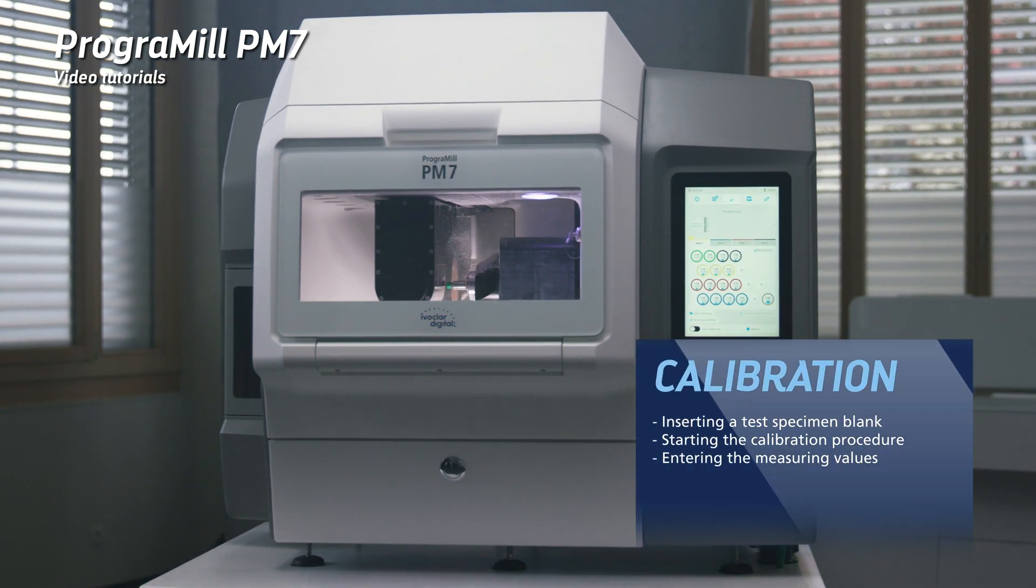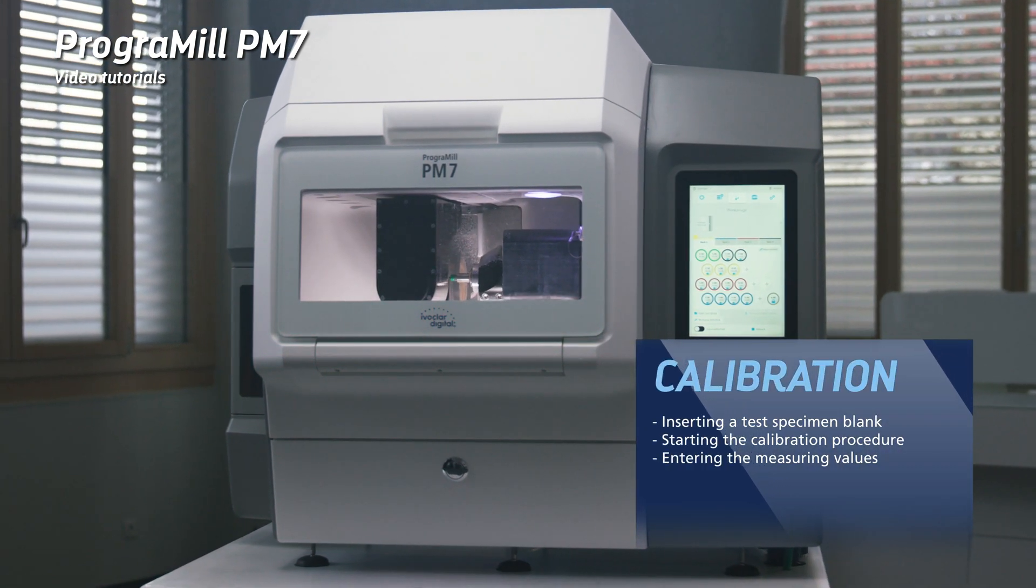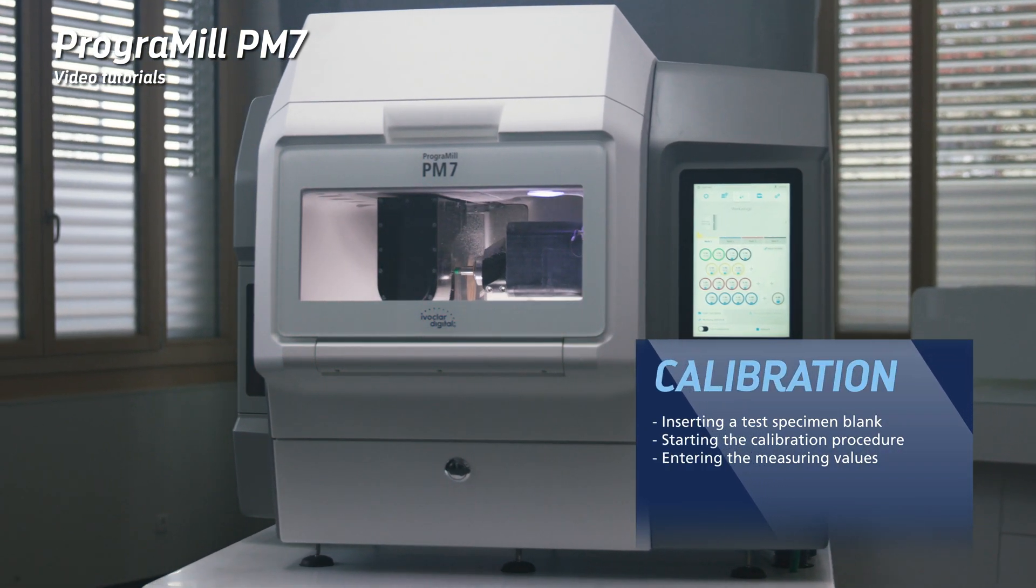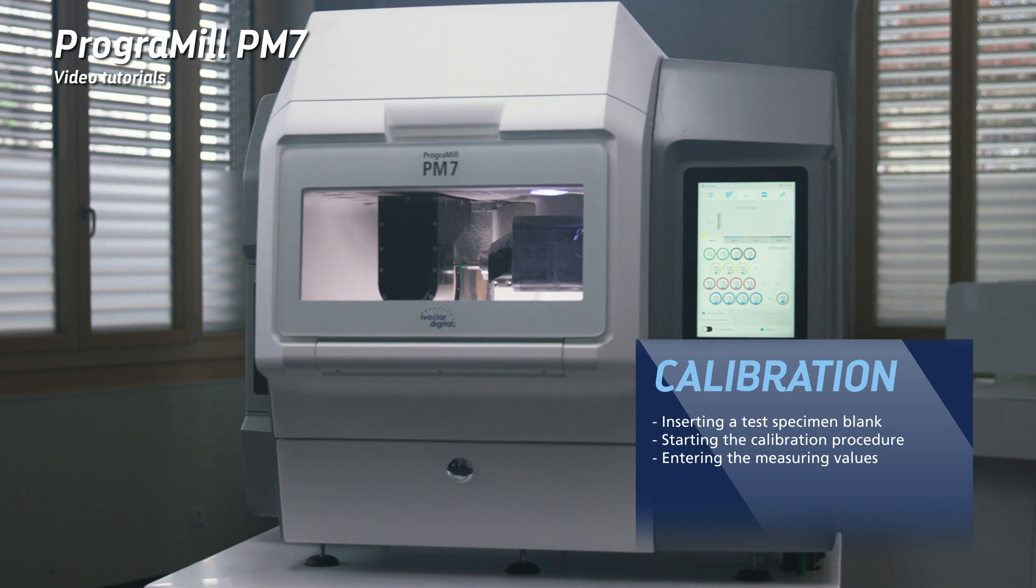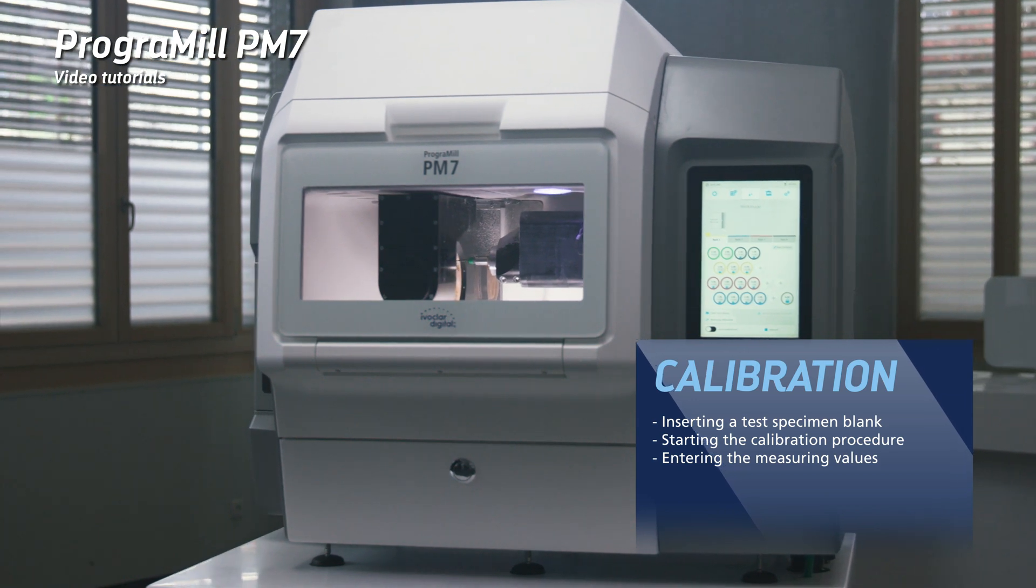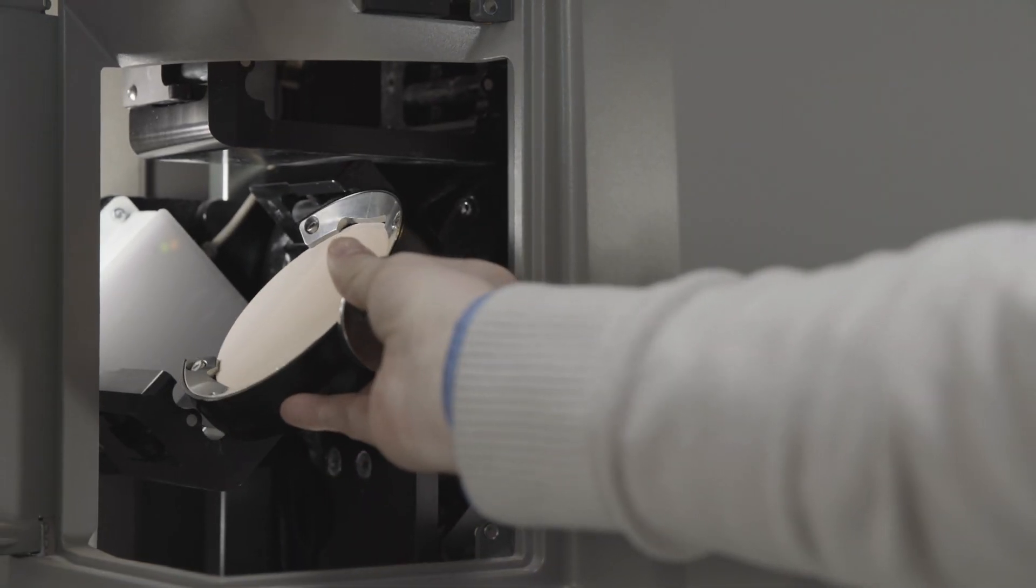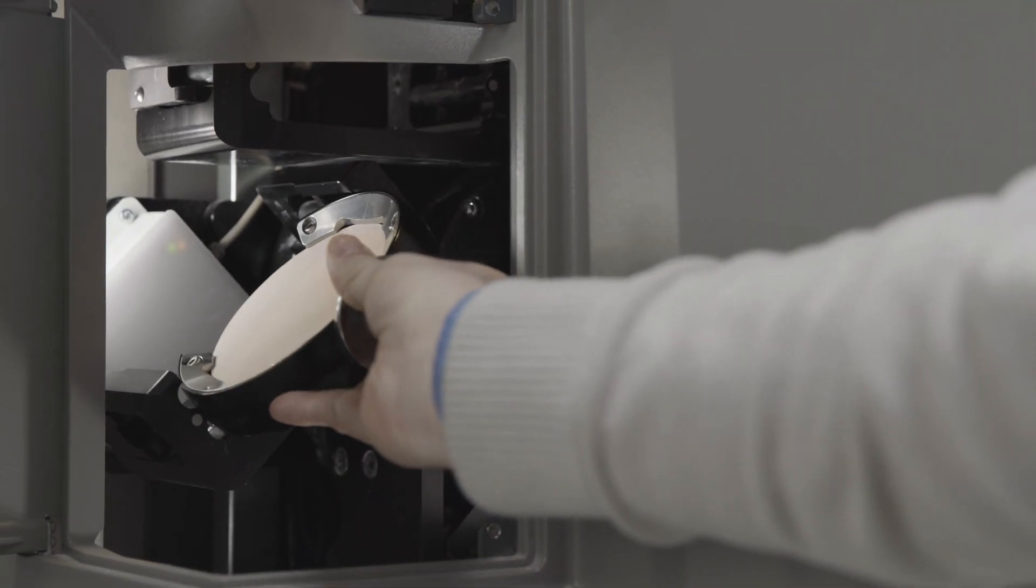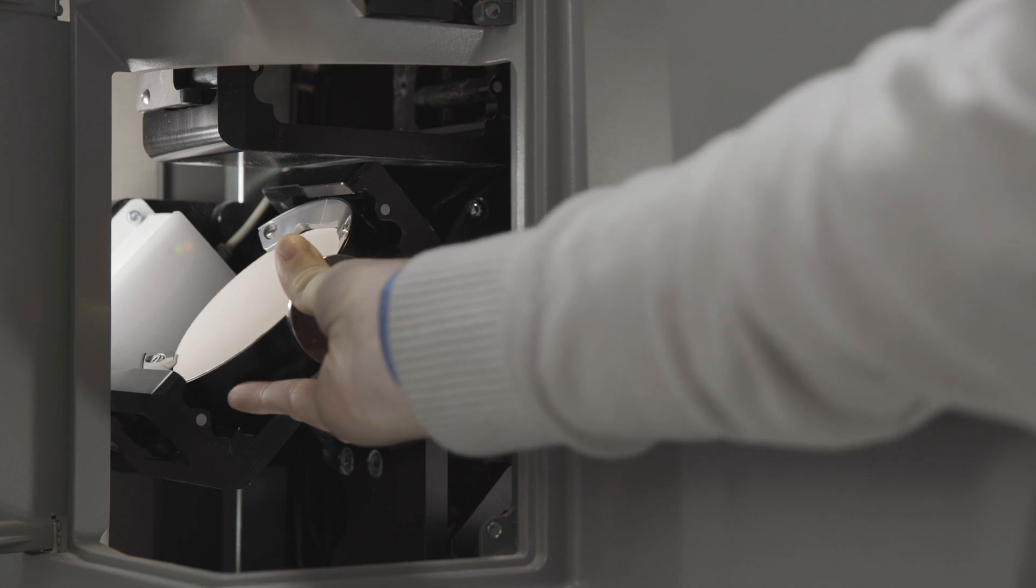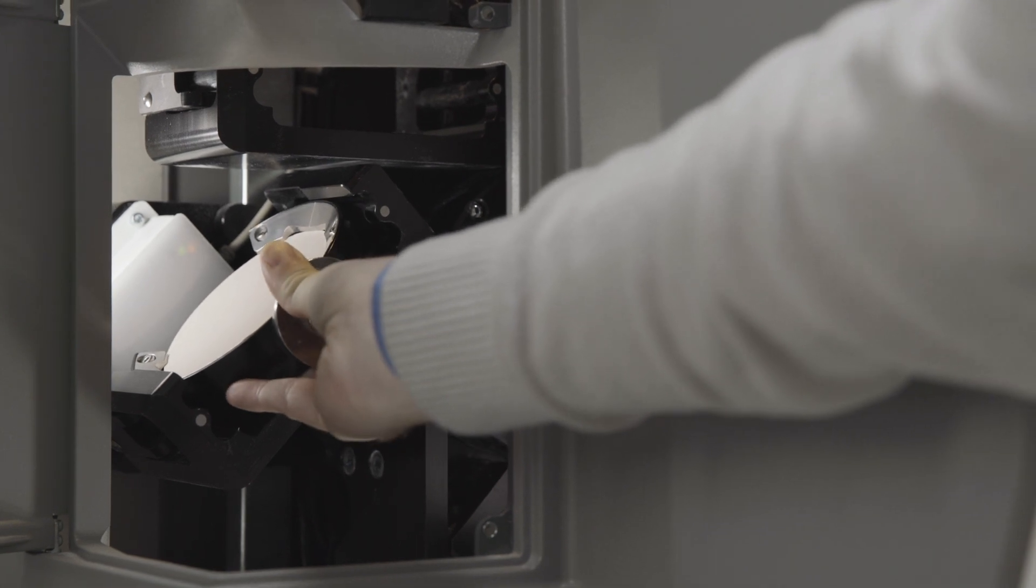This chapter shows you how to calibrate your device correctly. Place the test specimen blank into the machine using the material changer.